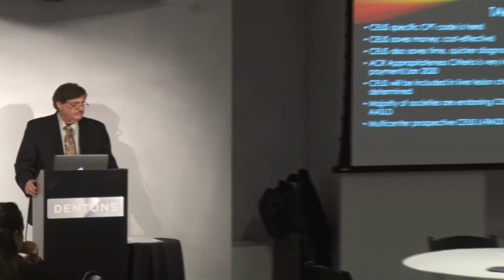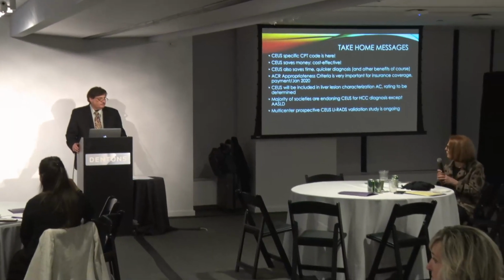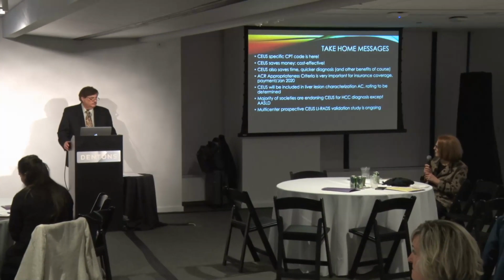And Richard knows, in Canada, we don't have an obsession with billing codes. And that's why we don't do enough. We don't get paid enough, or we don't do enough. But if I see a patient that has a liver mass, I immediately do an elastography of the liver, because it's important. I can't report it accurately when I get into that dilemma: is it LRM or is it non-hepatocellular malignancy? And those dilemmas are killer. So we can do an elastography. So what she's talking about is doing elastography to prove that the patient has chronic liver disease and is at risk for HCC. And we can do CEUS also. I don't ask anybody to do it, to have a requisition. And so I know it will never get that way in the United States, will it?